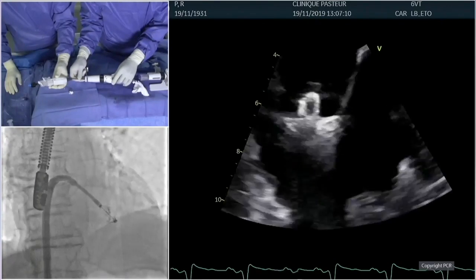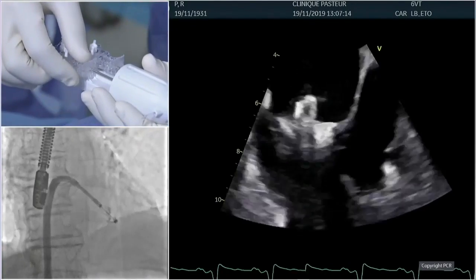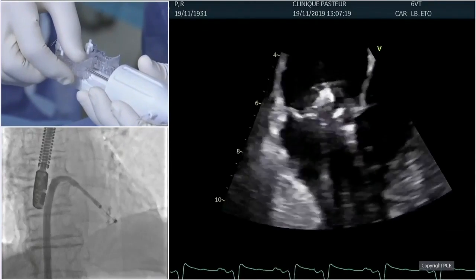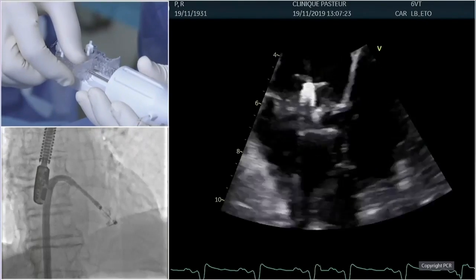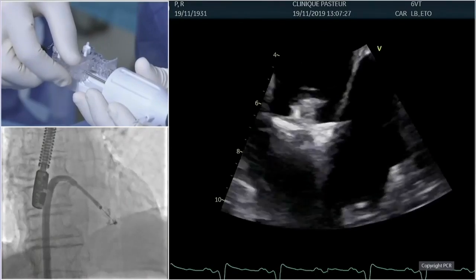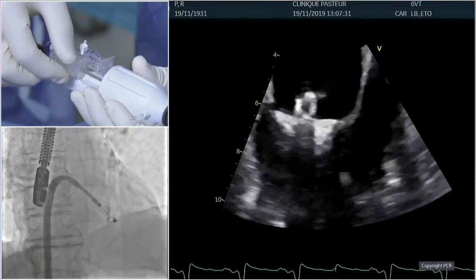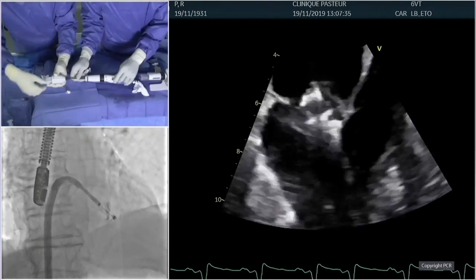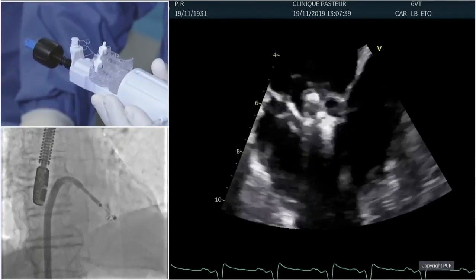And let's move a little bit more posterior. And let's take time. It's really necessary not to rush. Once we have a good LVOT view. Okay, don't move, Laurent. Thank you. So a more posterior, rotating posterior. Close a little bit more. Yeah, and clasp down and bouncing. Excellent, that's got it.